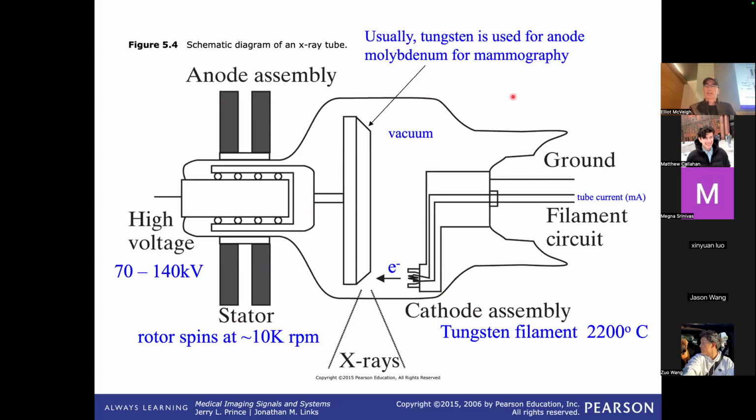So here's the graphic. We have this coil that's going to, when we put tube current through this thing, and this is a dial we have on a CT scanner, I can just click the tube current from 50 mA to 100 mA to 300 mA to 700 to now 1400 on our new scanner, right? We used to be stuck at 700. Now we can get up to 1400. And that produces a lot of X-rays. So a lot of current goes in here, a lot of electrons come across, fly into the target. This is our big motor that's rotating the target.